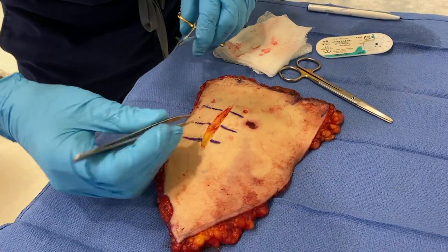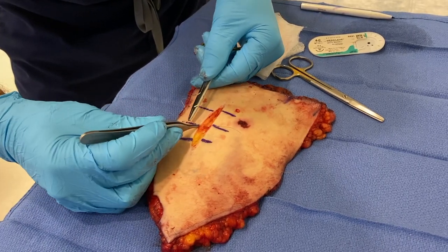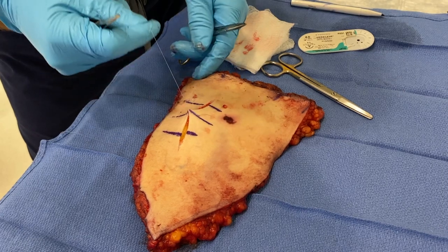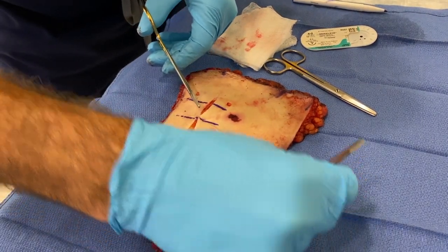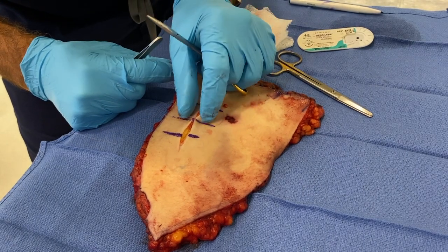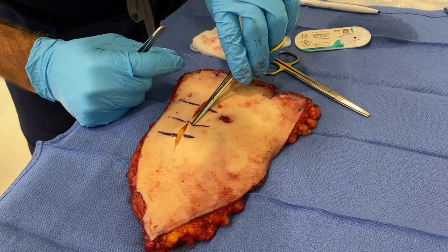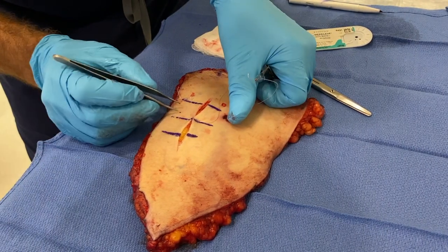We could tie that as a simple stitch, but maybe we're having trouble and when we bring it together the margins of the skin are inverting. If that happens, a vertical mattress is very helpful. With the second stitch, we come close to the edge and make it relatively superficial, near the margin — that everts the edge. Bring that together and see how it everts your tissue. All I have to do is three more throws to complete the knot. I want to make it loose enough that I can get a scissor in later to cut the stitch when removing the suture. That's a vertical mattress.